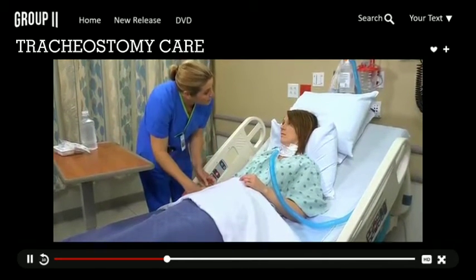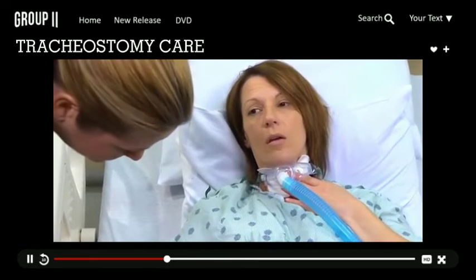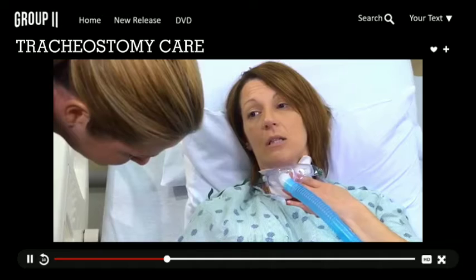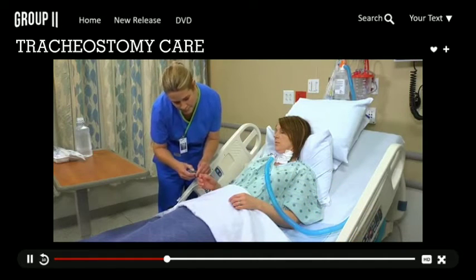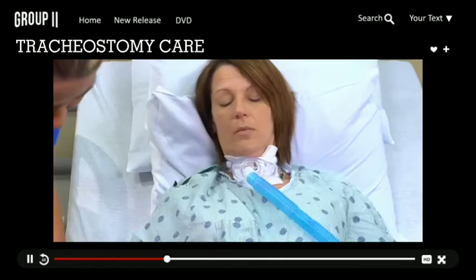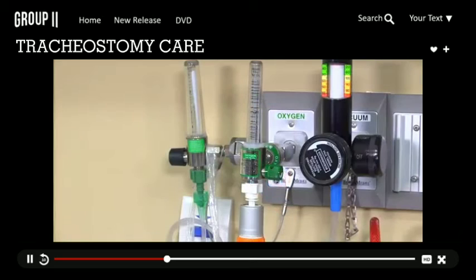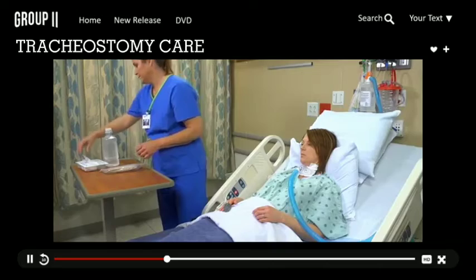Can you go ahead and tell me your full name and date of birth? Carolyn Lance, 3672. Begin your care by clipping a pulse oximeter to the patient's index finger. Either hand is fine. If oxygen delivery is needed, be sure that the sources and humidification are in place and have been set to the correct levels. Arrange your equipment on the overbed table.